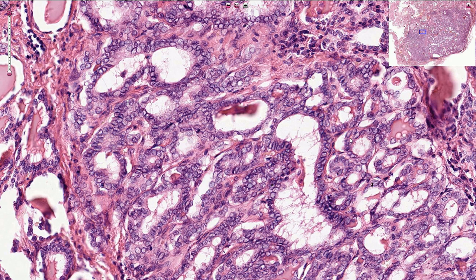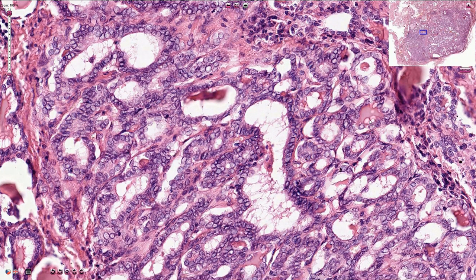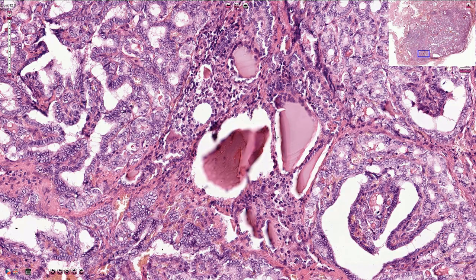A quite useful sign is also the different appearance of the colloid, which is slightly darker. It is sometimes described as a bubblegum appearance of the colloid, with scalloping and bubbles around the edges, and it is much darker and more pink than normal areas of the thyroid gland. This is a slightly better example of the thick dark colloid.